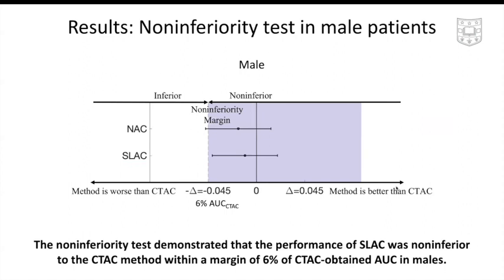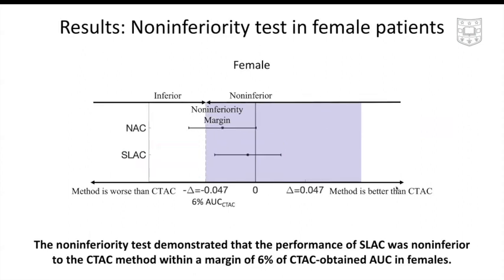We also evaluated the performance of the SLAC method in different sexes. In male patients, we observed that the performance of the SLAC method was non-inferior to the CTAC method within a margin of 6% of the CTAC-obtained AUC. And we observed the same findings in the female patients.